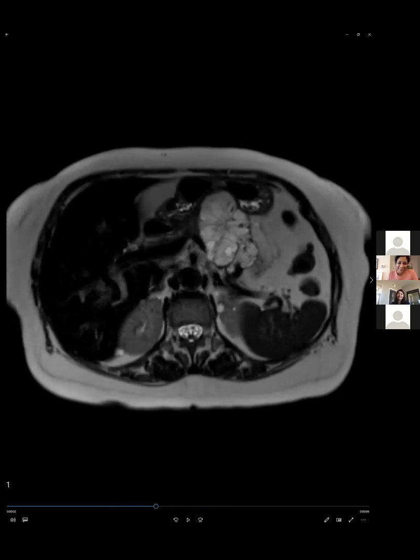Okay. Yeah, so we called this a benign SCA. She was having vague abdominal symptoms, but not something serious enough to take it out, so they're going to follow this. To me, it was nice because the CT showed that, while those differentials were great, solid looking masses can actually be these microcystic lesions. So you might argue MR would have been a better next step to save her the EUS and biopsy and everything.